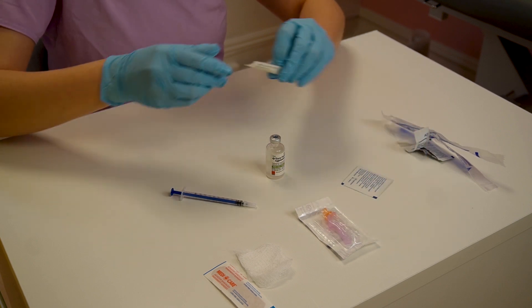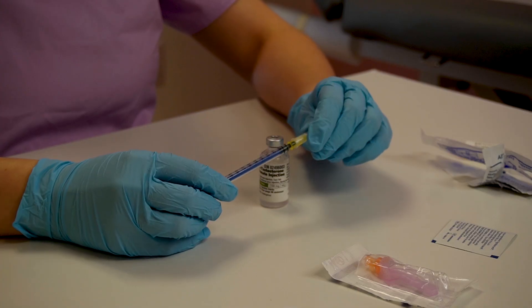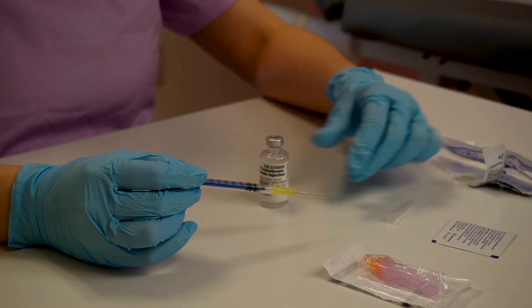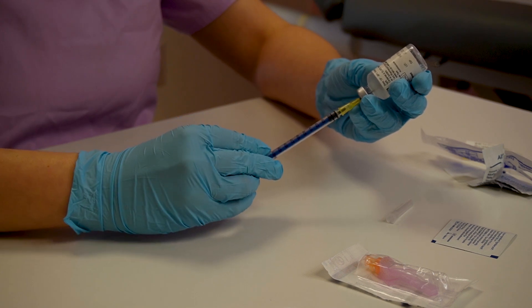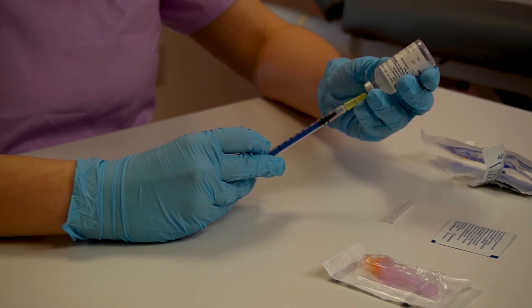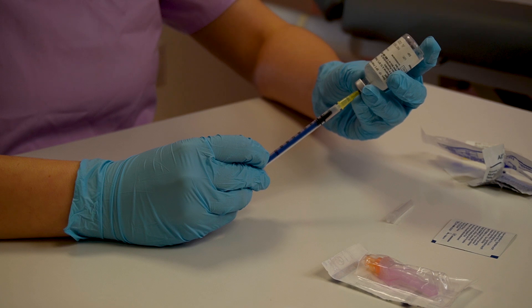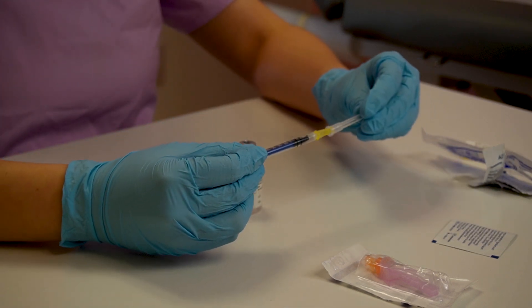Unwrap the big needle too — the needle I use here is a 20 gauge, one inch needle. We need to inject just a little bit of air first. The initial dose is usually 0.2 milliliters or even 0.1. Decap the needle, inject it into the bottle — you've already cleaned the rubber stopper — invert the bottle, inject the air, and start drawing up as much medication as you need. The medication is usually very thick so sometimes you can have air bubbles. Make sure the bevel of your needle is in the bottle so you draw up liquid, not air. Invert again, remove the needle, place the cap back, and we're done getting our medication into the syringe.